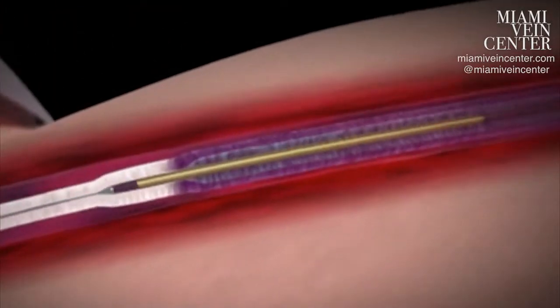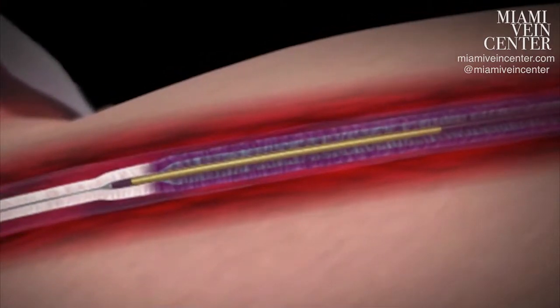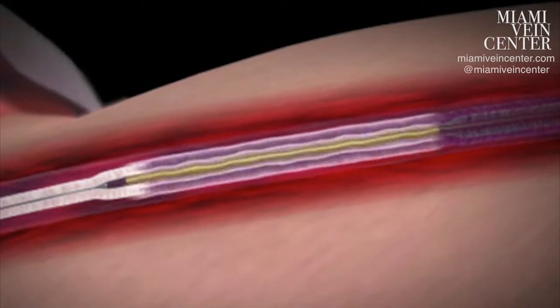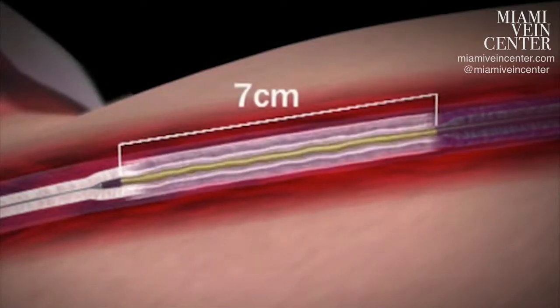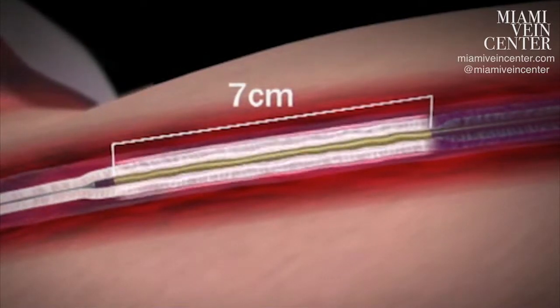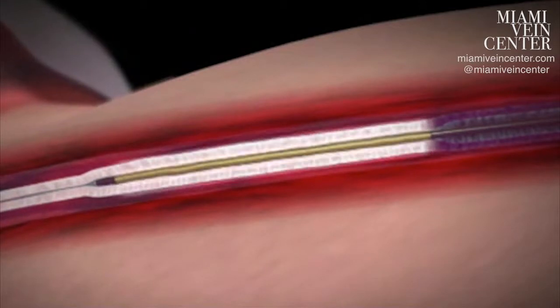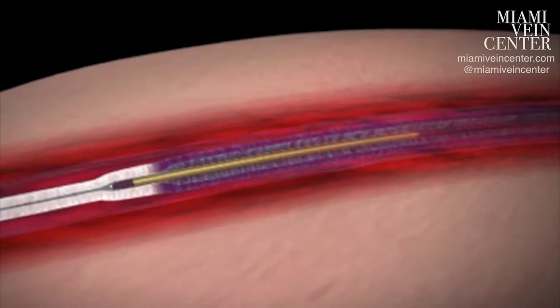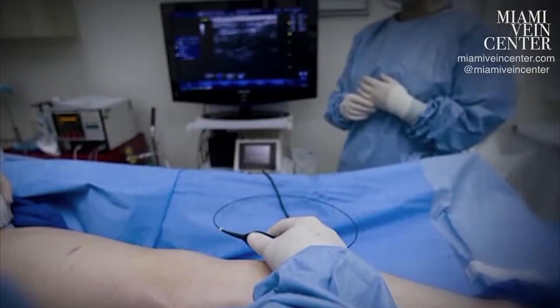It's the same end result as endovenous laser ablation in that when we look at the vein with ultrasound at 1 month, 6 months, or a year afterwards, what we will see time by time is shrinking of the vein and eventual disappearance of the vein. That's the ultimate result. We can take the great saphenous vein out of the circulation because it's not a main vein. The main veins are deep in the muscles. These are the femoral and popliteal veins. And as long as these are normal, we can remove a sick vein out of the circulation.